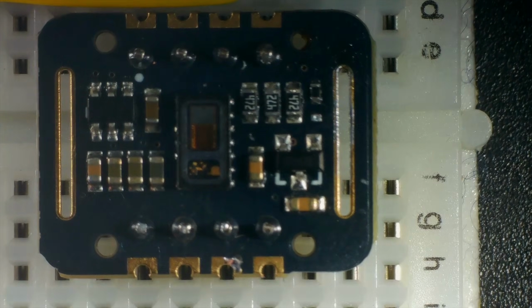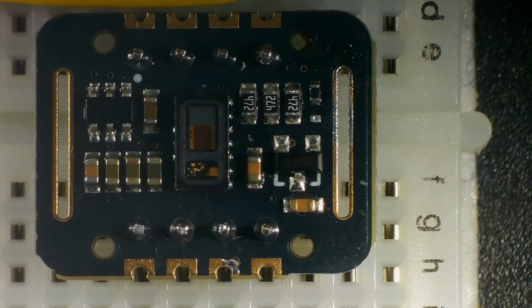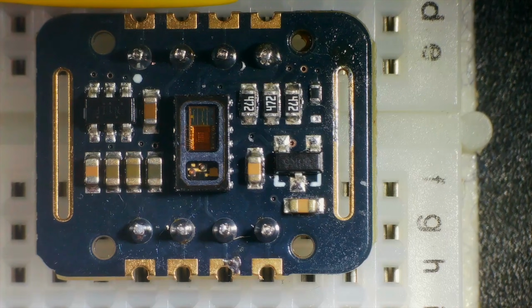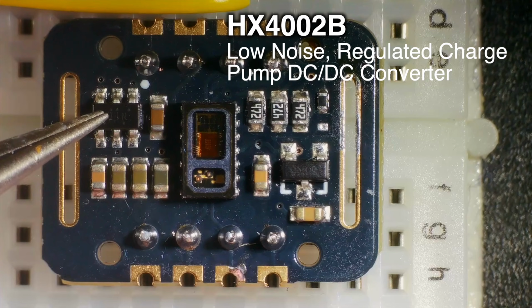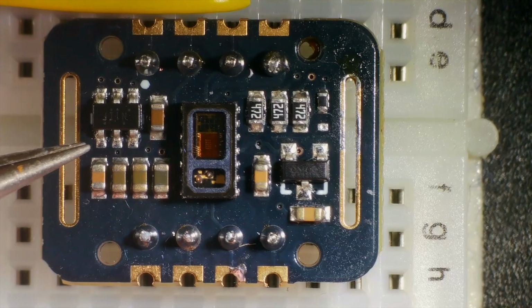I have this quite nice heart rate and blood oxygen monitoring module that I got in the recent AliExpress unbagging. So this is a MAX30102. It's pretty interesting. So on this board, we do have a variety of things. So let's just get focused. The first thing to note is we have this 3.3 volt regulator. This is a little boost IC. You can take a variety of voltages in and it gives 3.3 volts out on this pin. Seems to be pretty solid as well.